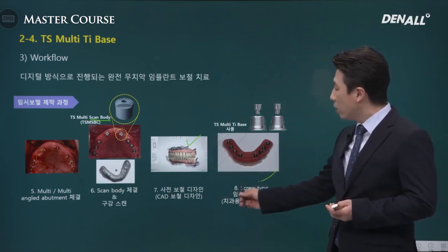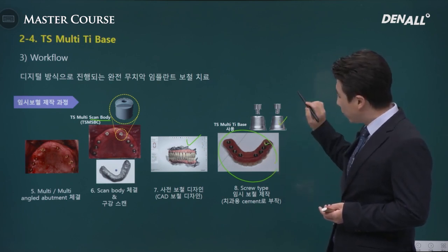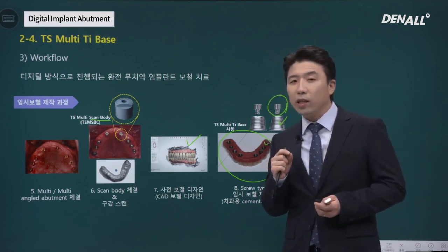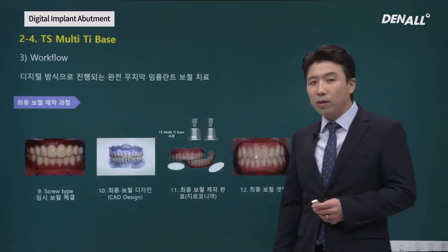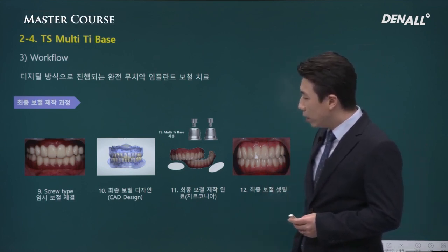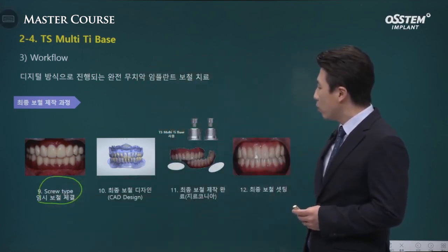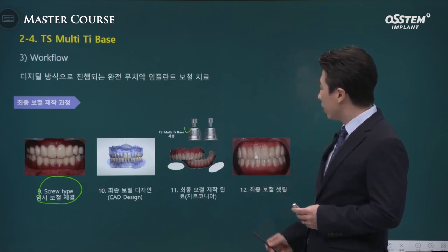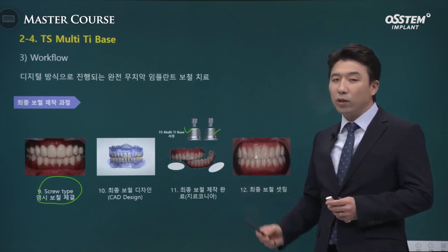Within the prosthesis, there is a cylinder. That's the same one. Occlusal screw is used to retain the prosthesis. This is a connection structure. This is an important option when using multiple implants. In the end, we can provide a provisional first. When designing final prosthesis, as mentioned earlier, we use cylinders used for multi-units. Different materials such as zirconia can be used for segmentation.